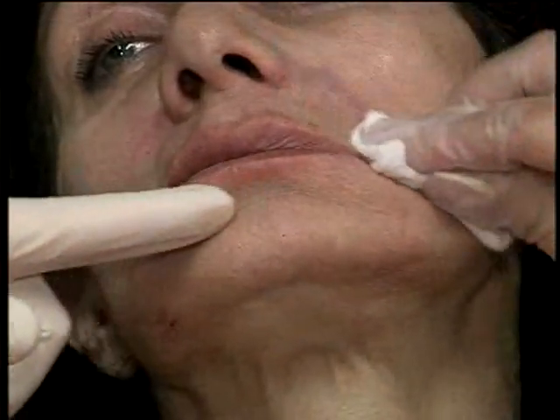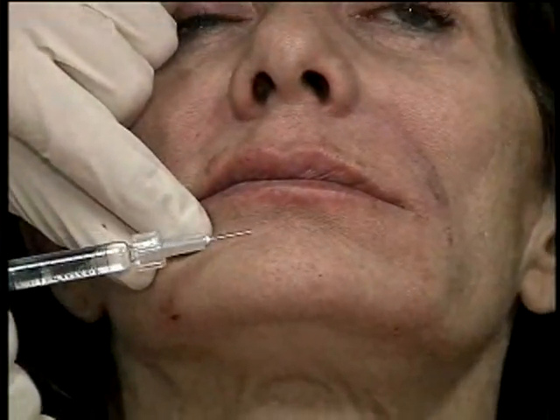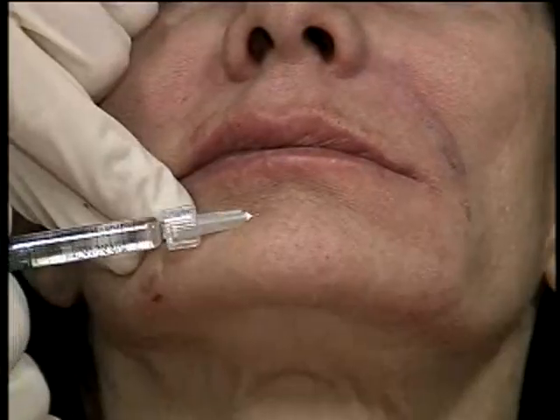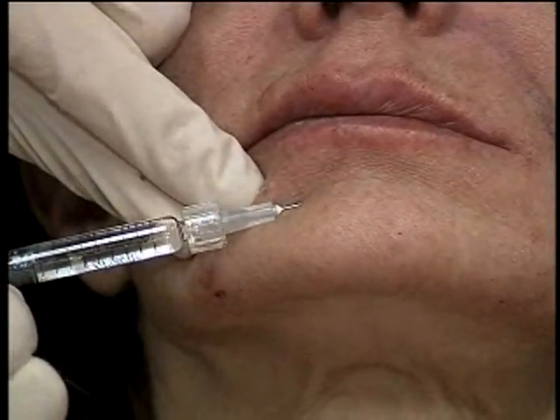So we're going to continue in the lower 1/3 of the face, and this is an area I will sometimes treat as the mentolabial sulcus. It's not too often I treat this, but occasionally I do. I come into the deep dermis, and I do a threading method here.